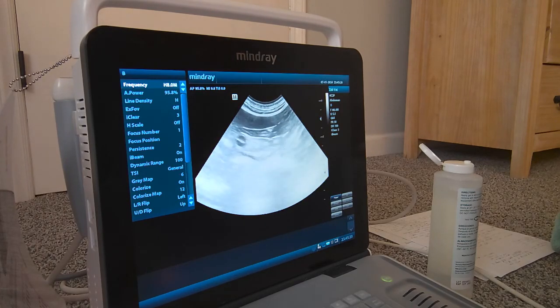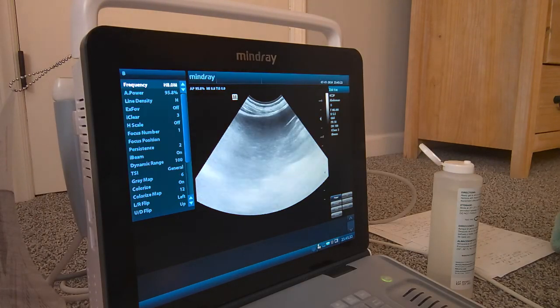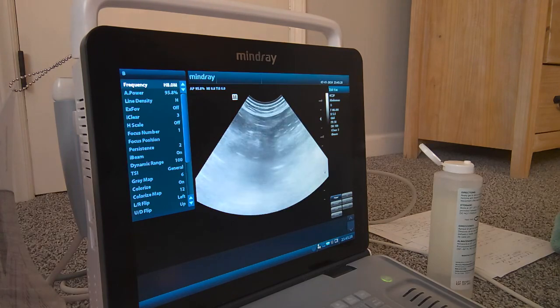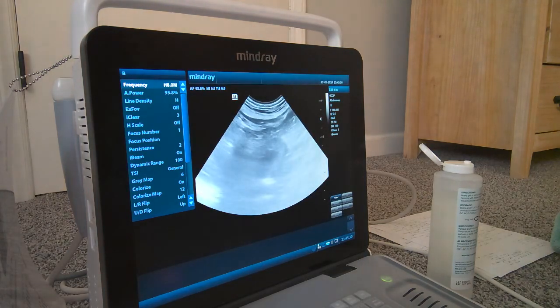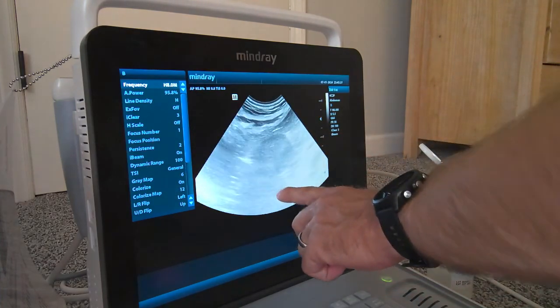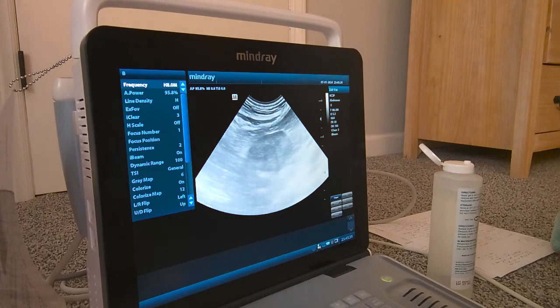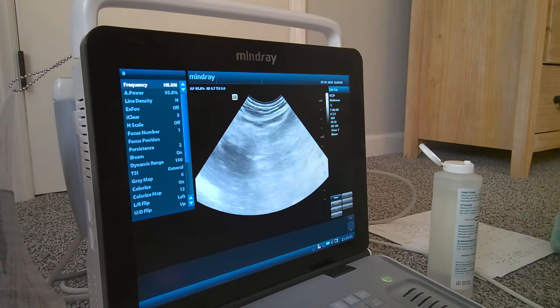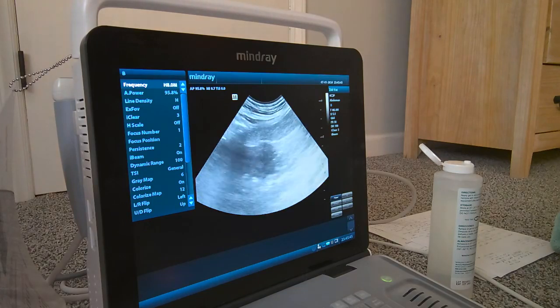What else? When we come back here, normally my splenic exam is done. If you go on just a little bit further caudal from the spleen, that's typically where the kidney is going to pop in. So now we start seeing kidney. We've got colon right there, so sometimes that makes the kidney a little bit harder to find. But we'll look at kidneys in a second. If I change my depth and everything, better shot of the kidney there.